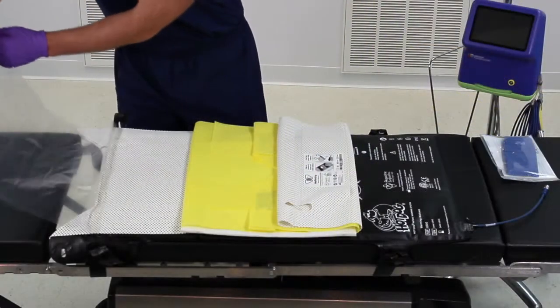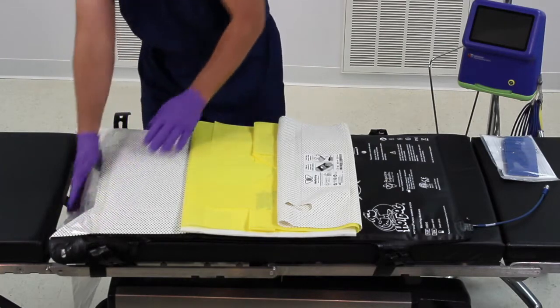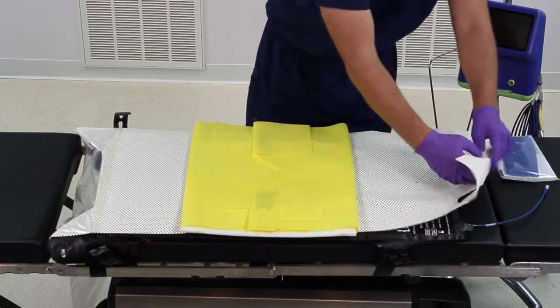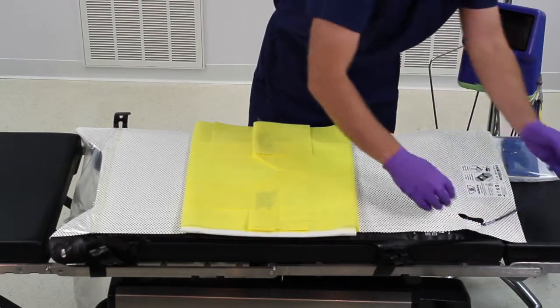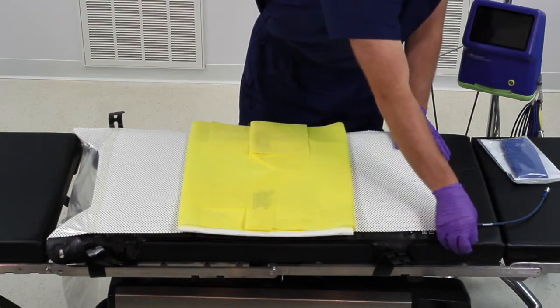Do not leave the plastic drape under the patient, as it could prevent Waffle Grip from performing and result in patient movement during Trendelenburg. Thread the blue power entry cable through the hole on the waffle grip pad. Fold the excess waffle grip pad at the head end underneath the warming mattress.